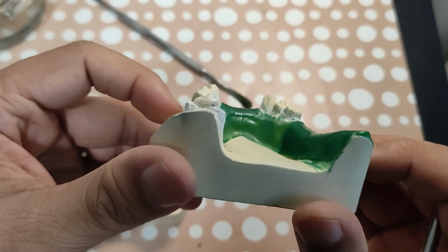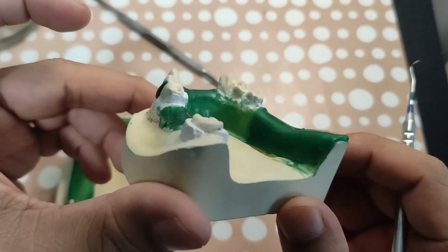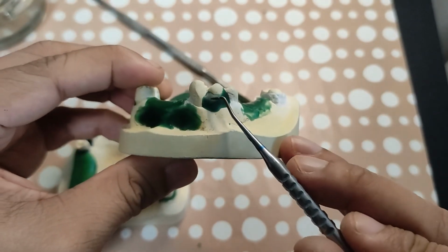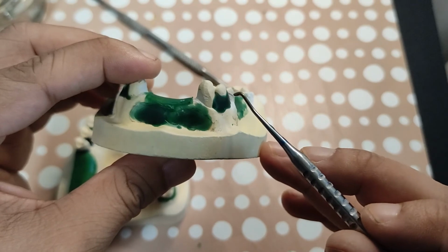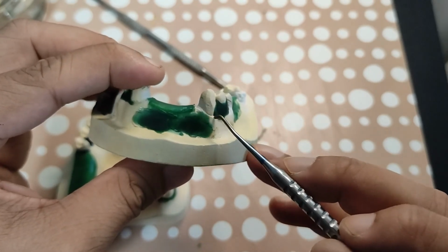Like I've mentioned, we use plaster for the shaped blockout and for the parallel blockouts. It's luted all around. This wax here is for arbitrary blockouts. Maybe I'll extend it a little past. I did it hanggang dito.